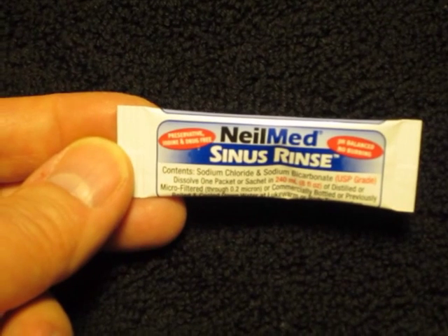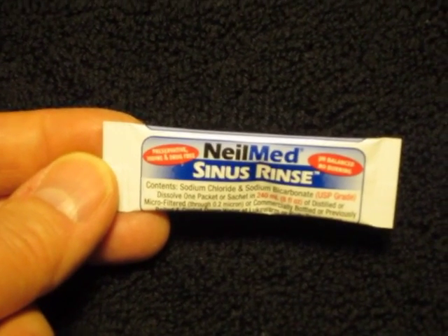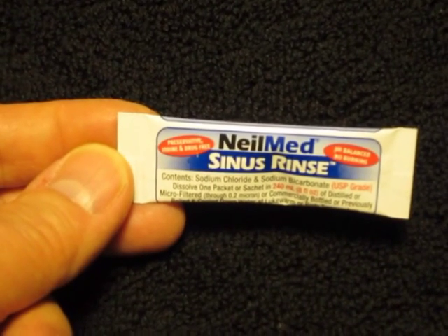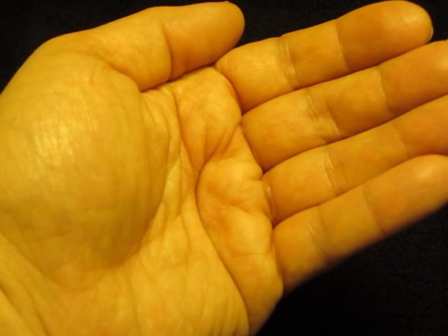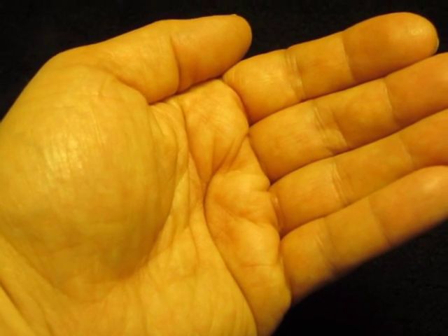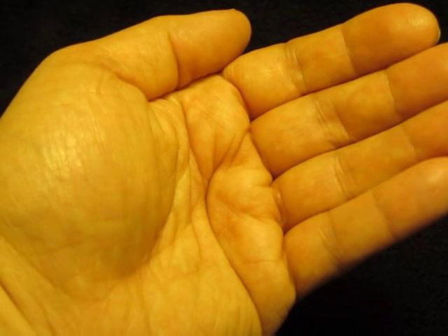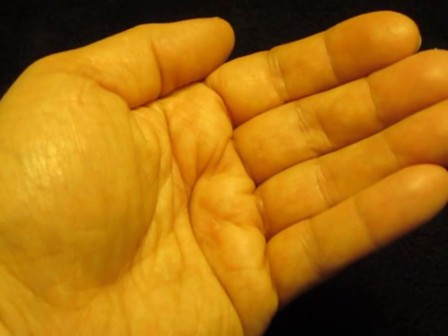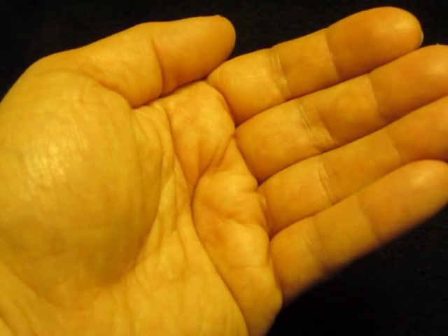NeilMed salt, labeled as sinus rinse, is sold in most drugstores in North America. You can pack any of these small packets into your luggage when you travel. The most basic irrigation device is your cupped hands — you can hold water in your cupped hands and simply snort the water into your nose and then blow it out again. But this method does not work well when you want to have the salt dissolved in the water.